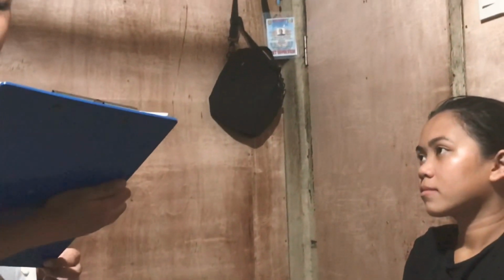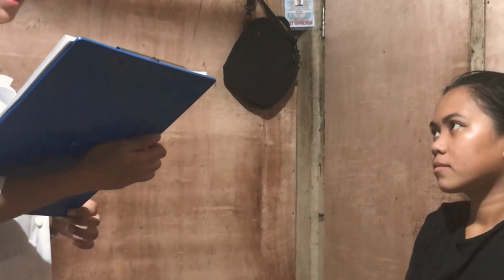And now, I'm going to demonstrate to you the taking of blood pressure and also ensure the patient's privacy and help her into a sitting position. And it is necessary to get the blood pressure to get an accurate blood pressure reading so that you have a clearer picture of your risk of heart disease and stroke. A reading that says your blood pressure is low actually may give you a false sense of security about your health. And blood pressure is the pressure of circulating blood on the walls of the arteries.